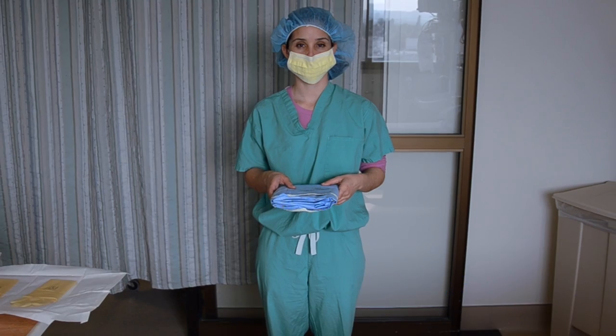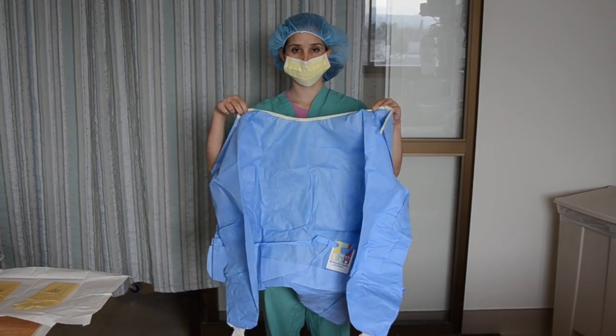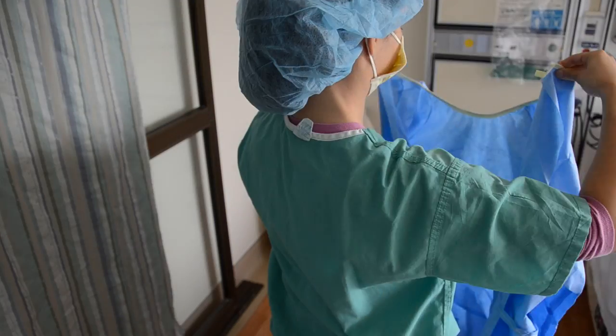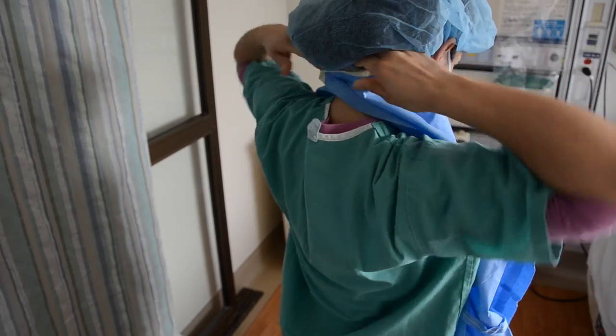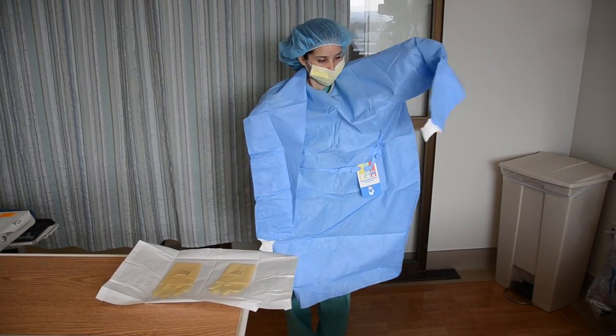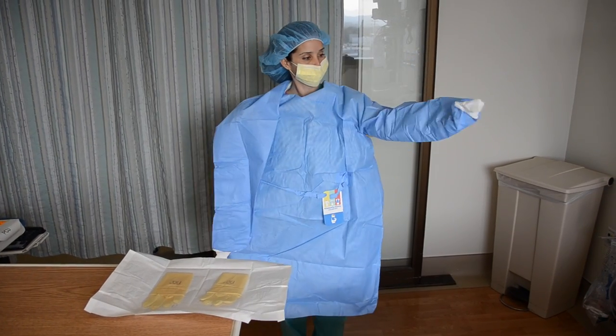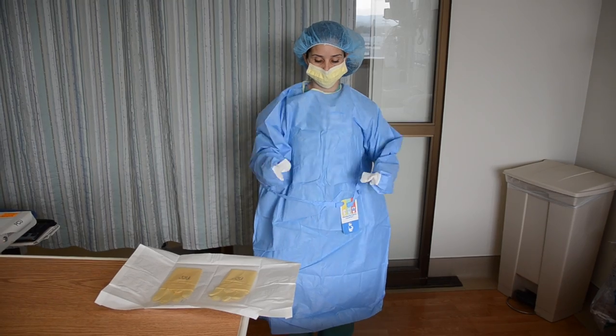This video shows the proper technique for donning a sterile gown and gloves in the ICU. The physician first unfolds the sterile gown. She then attaches the Velcro tabs behind her neck. The arms are advanced into the sleeves without advancing the hands beyond the fabric at the end of the sleeves.